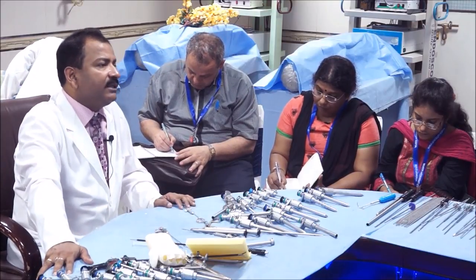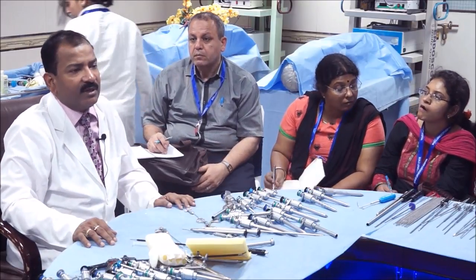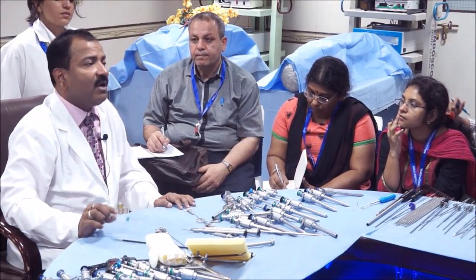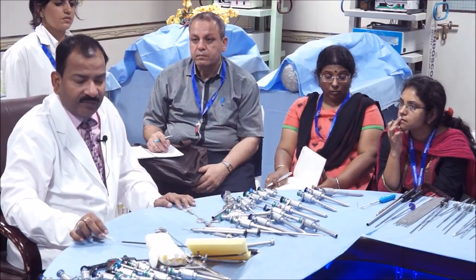Gamma chambers are only available in very sophisticated high-end hospitals. Generally, we don't prefer the gamma chamber, and in India, we don't use it for these instruments because the cost will be so high. 40 lakh rupees is the cost of the chamber itself. Cost will be so high that if you will use that much money, then it is better to use disposable. Disposables are cheaper because if you see the interest on that much money, 50 lakh rupees, then you can use the disposable and you can charge the patient also. But you use disposable only if you are rich. If you are poor, then you should use reusable. But if you are using disposable as a reusable, that means you are very poor.